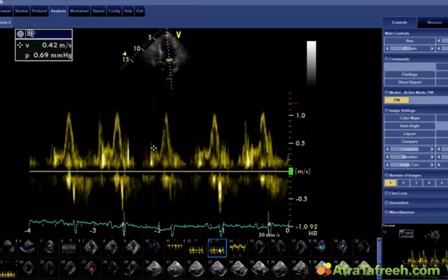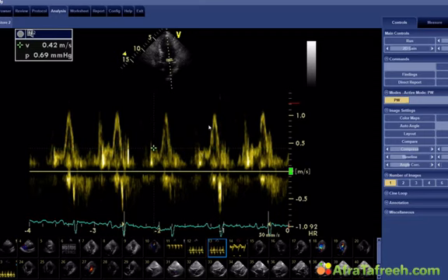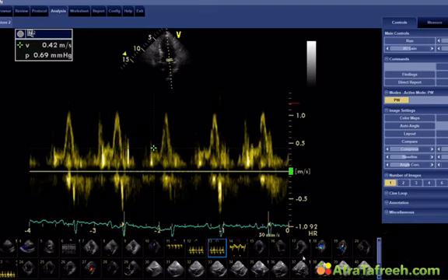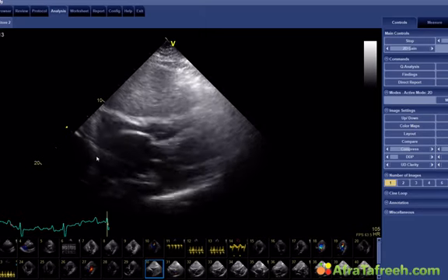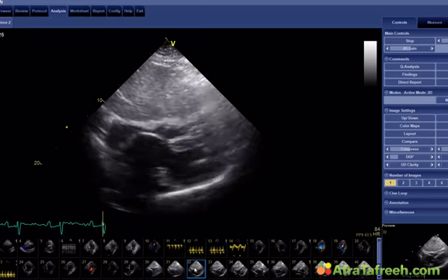Now let's turn to diastolic function. We have an E to A ratio here, where the E wave is smaller than the A wave. Typical pattern of impaired relaxation. And now we will turn to the subcostal views. Again, you see the dilated aorta. This is the right ventricle, the left ventricle. Show you another view.